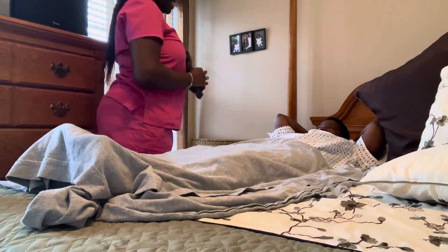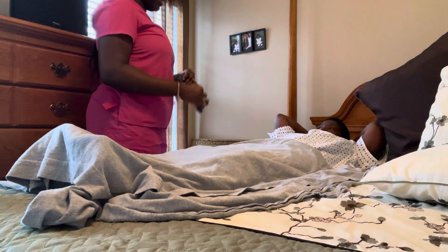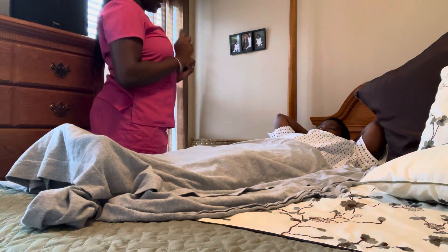Good morning, Ms. Lee. My name is Journey Williams. I'll be your CNA for today. And today, I'll just be assisting you with putting on your elasticized stockings. Is that okay with you?